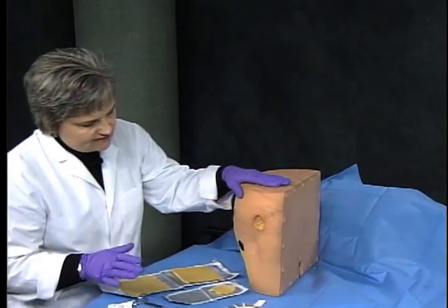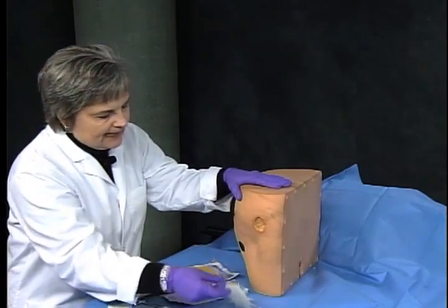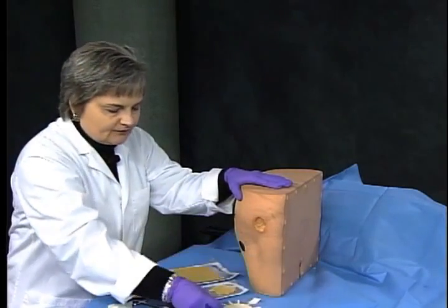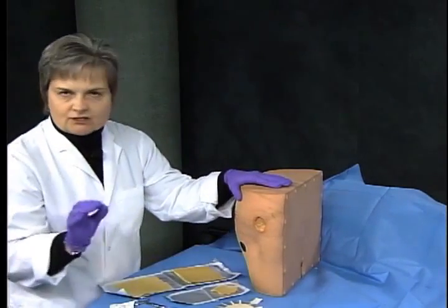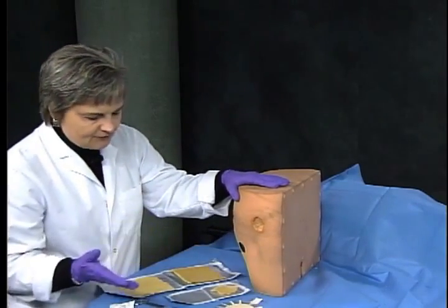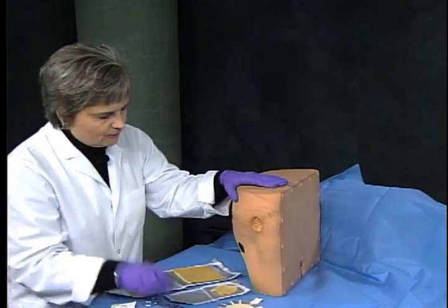So at this point in time, I'm ready to go ahead and apply my cover dressing over the wound, and I'm going to hold off on putting that on for just a minute because I want to show you another application technique in this particular wound. So say, for example, I don't have scissors, all right? I don't have an ability to cut.